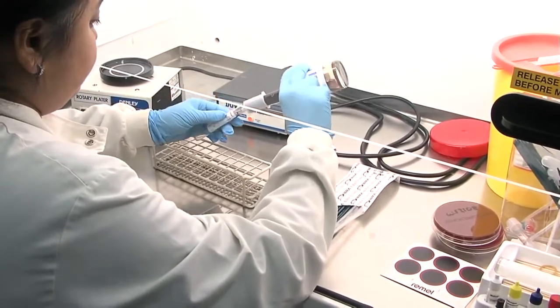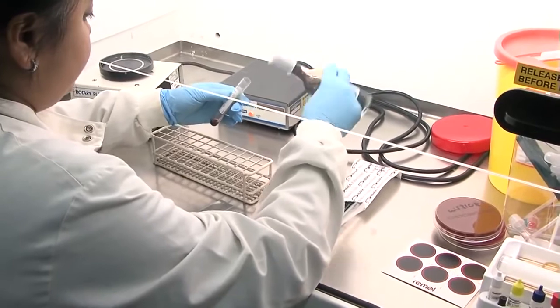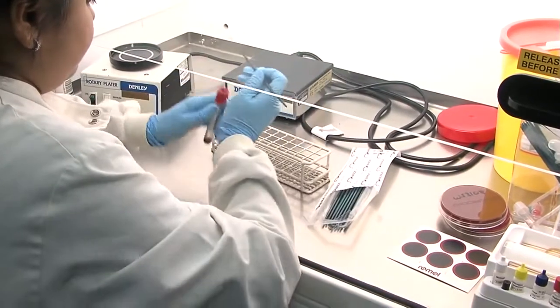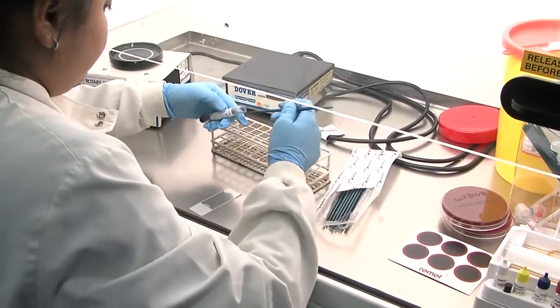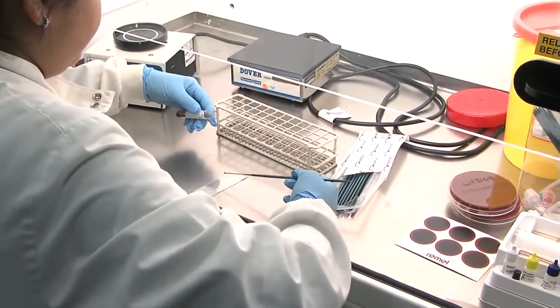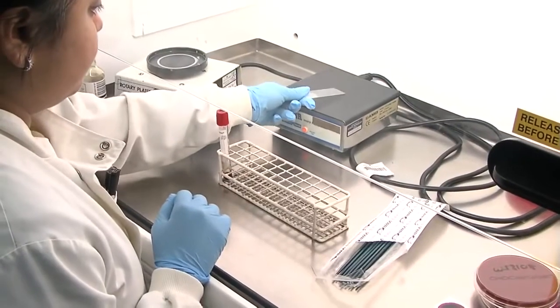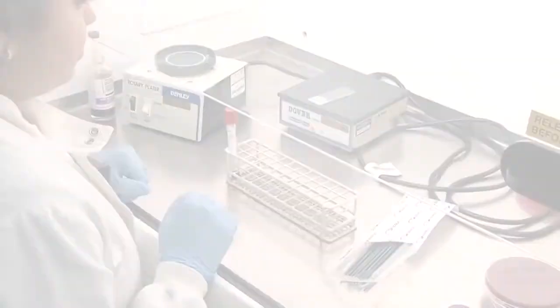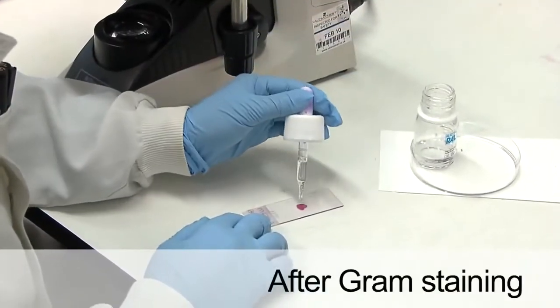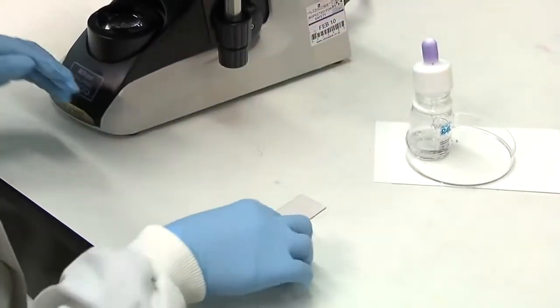A sample of blood is removed from the positive bottle inside the Class 1 safety cabinet using a venting device. A microscope slide smear of the blood is made and heat fixed prior to gram staining. The gram stain slide is then examined under a light microscope at a ×1000 magnification.